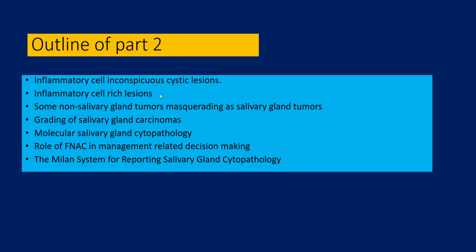Inflammatory cell rich lesions, and then I shall go on and show you some slides of non-salivary gland tumors which might masquerade as salivary gland lesions, especially if you do not have access to the imaging findings. They can be very confusing.